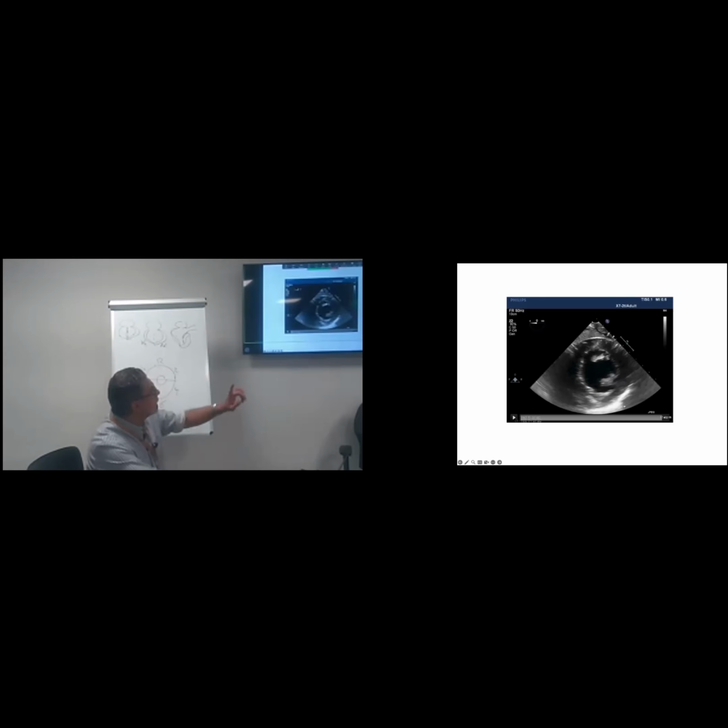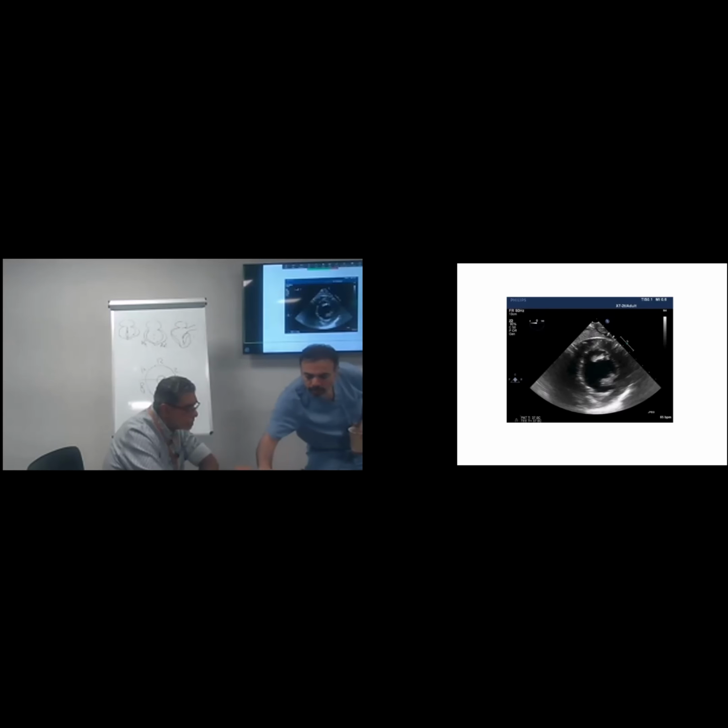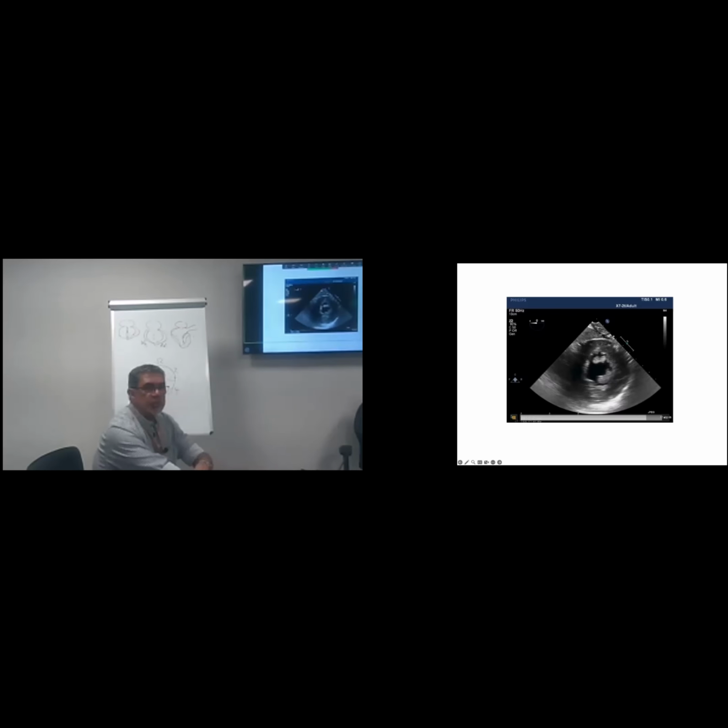Dr. Ibrahim, stay so you can enlarge the picture. Okay. I don't know. What is the original regional motion here? Okay, how to do next?